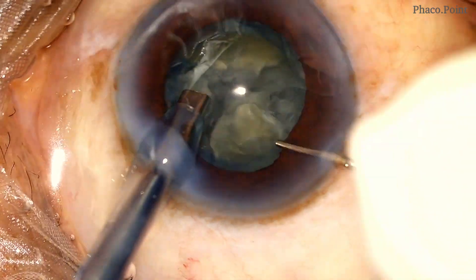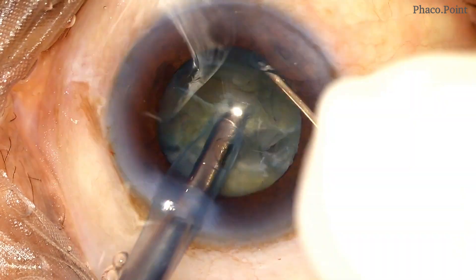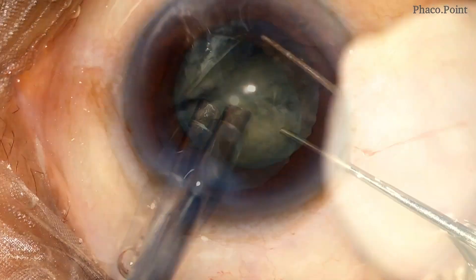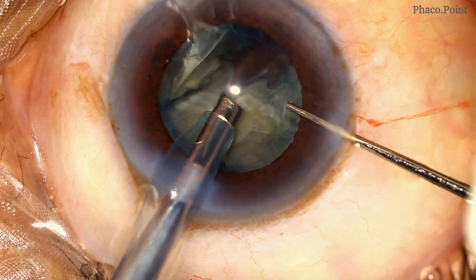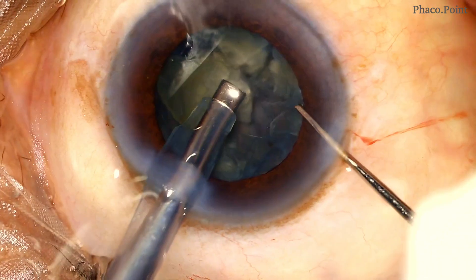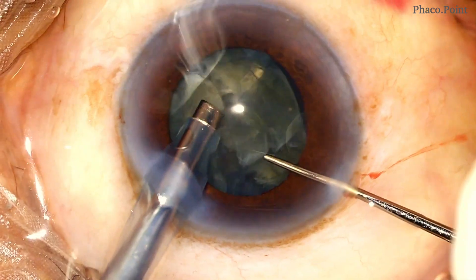Once downsized, each of the fragments is brought up into the pupillary plane and subsequently emulsified. The nucleus disassembly and emulsification seems to be going rather well.